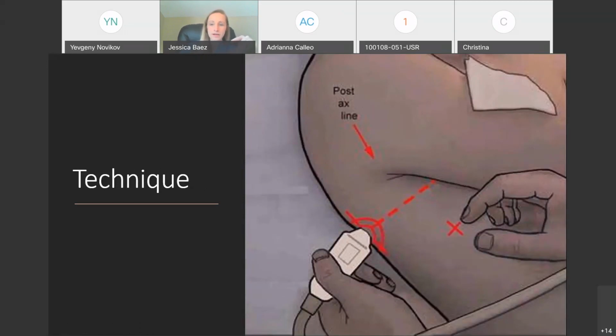So exactly where it is, you extend an imaginary line from basically the nipple line or the inframammary crease in females over to the posterior axillary line. And again, that's the most dependent point in the thorax. So in a supine patient, this is where small pleural effusions are going to accumulate. This is where B lines or pulmonary edema, you will see here first before it extends throughout the rest of the thorax. And most pneumonias actually have a component in this area as well. So it's a fairly high yield point that you definitely should include when you are scanning for lung ultrasound.